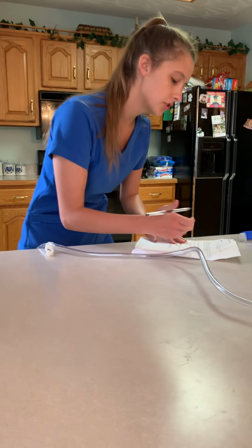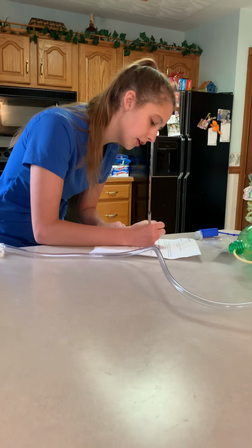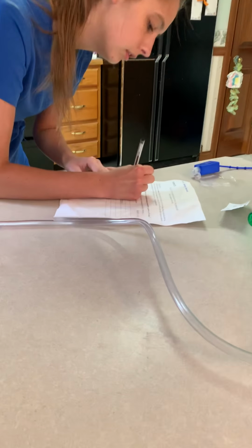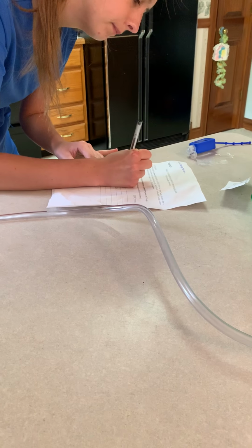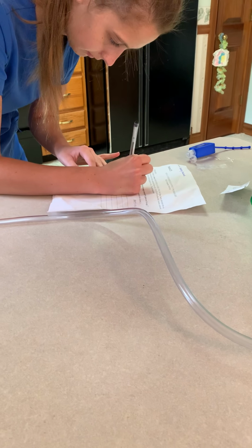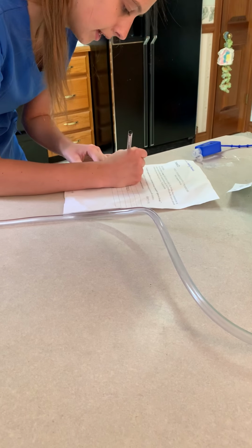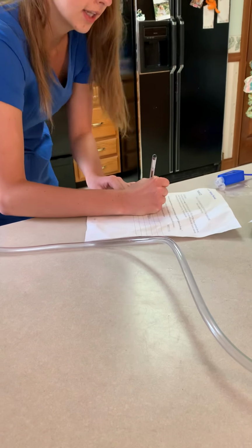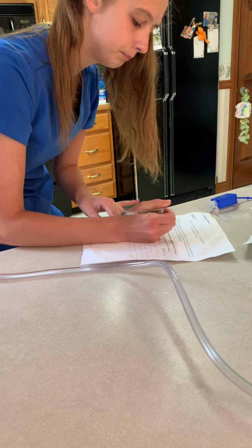So I'm going to document that the patient's urine was a pale yellow color and that it was clear. And then I would say the patient had about 150 milliliters of output.